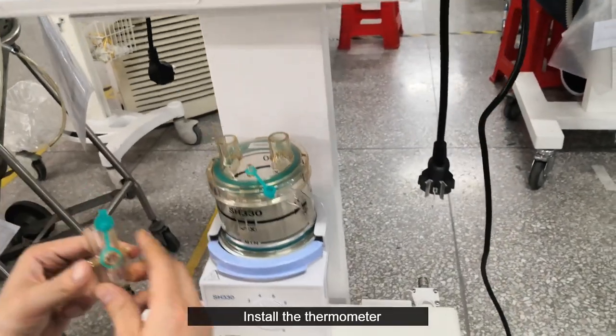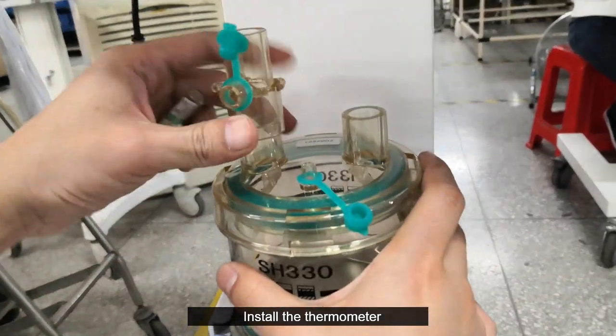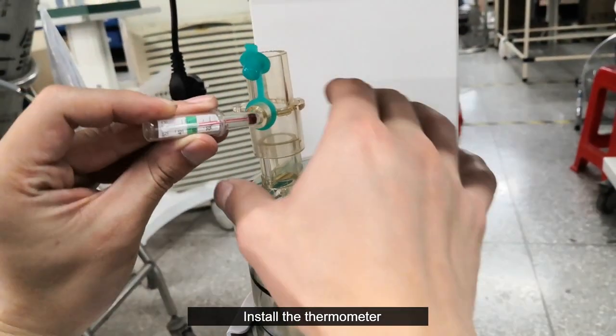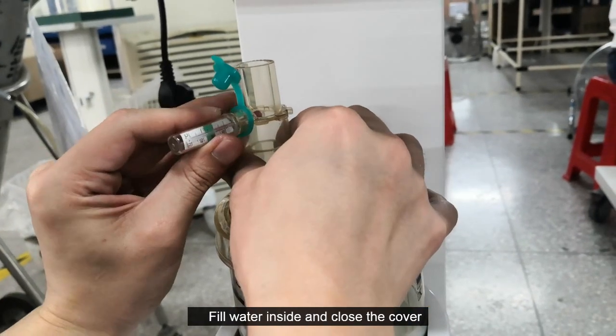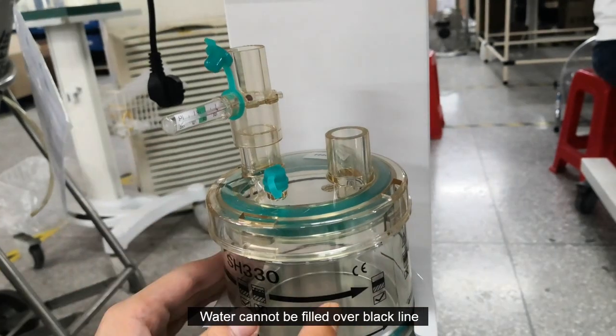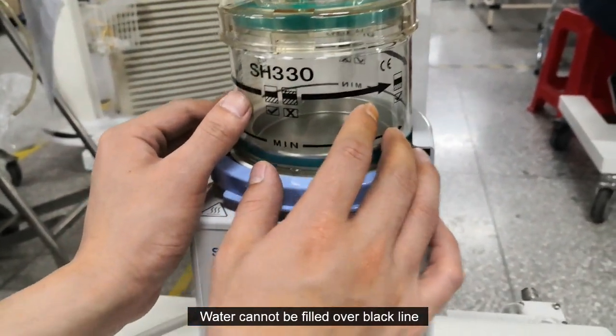Install the thermometer. Fill water inside and close the cover. Note that water cannot be filled over the black line.